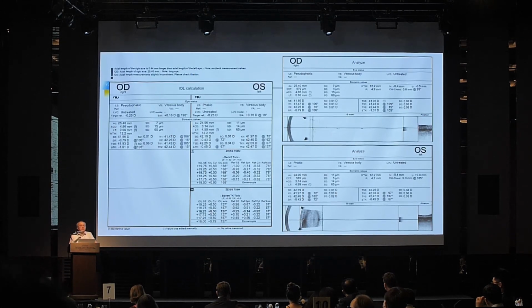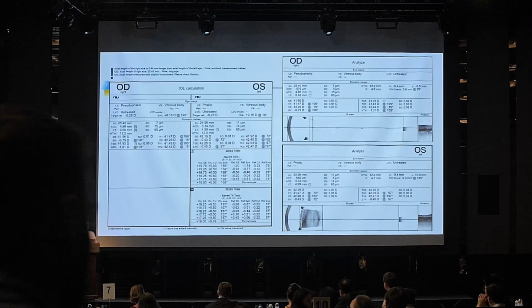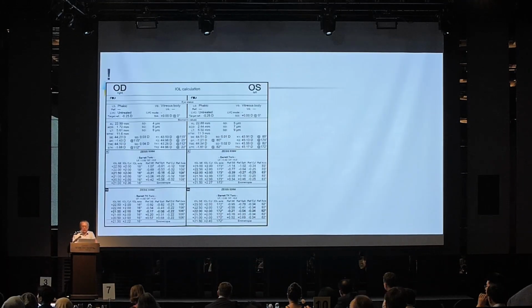Alright, like I said, it may not be that the patient is not fixating, it may be that there's something else with the macula. So you might want to proceed on to do retinal OCT, or you might want to repeat the measurement. Okay, this is a shallow ACD, and it's important to know this.